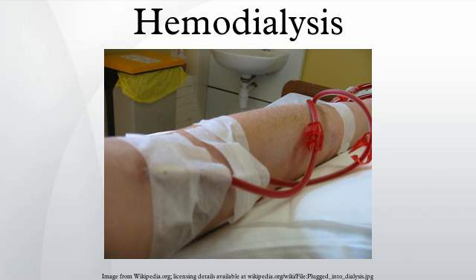A collaborative randomized trial from Europe, the MPO study, comparing mortality in patients just starting dialysis using either high-flux or low-flux membranes, found a non-significant trend to improved survival in those using high-flux membranes, and a survival benefit in patients with lower serum albumin levels or in diabetics.